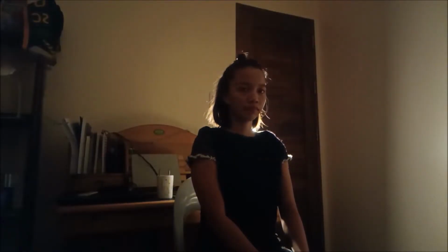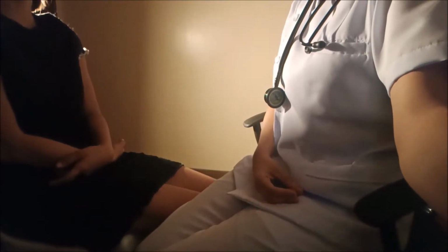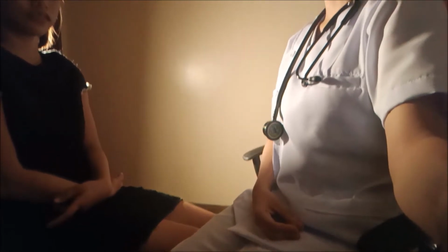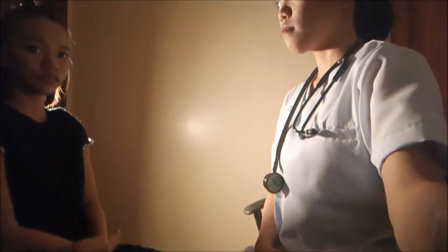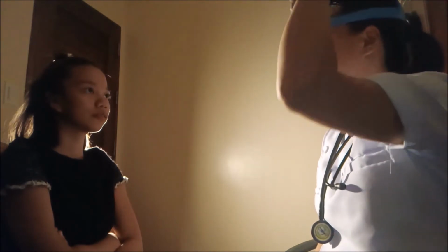Have the patient sit straight with both feet on the floor. The examiner is seated opposite to the patient with legs uncrossed and both are on one side. The light source is positioned slightly above the shoulder on the side behind the patient. The head mirror is placed over the examiner's eye as close to the face as possible. Direct the reflected light to the patient.